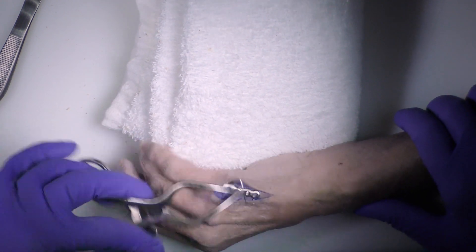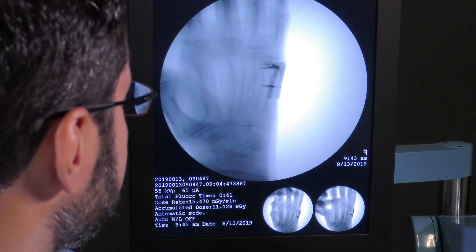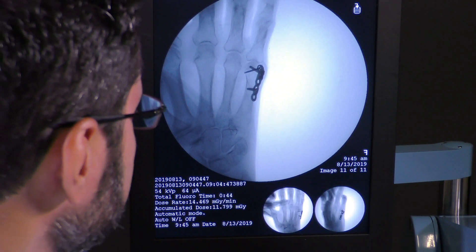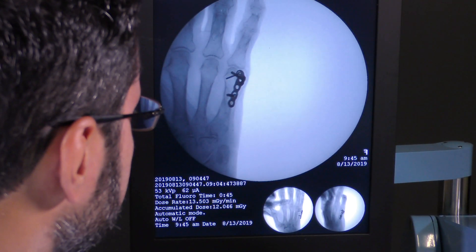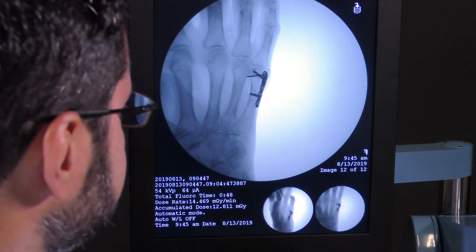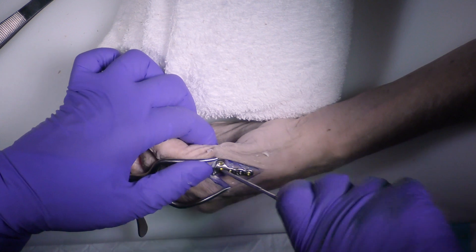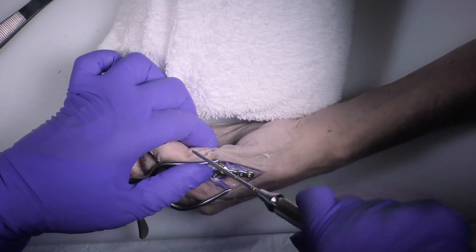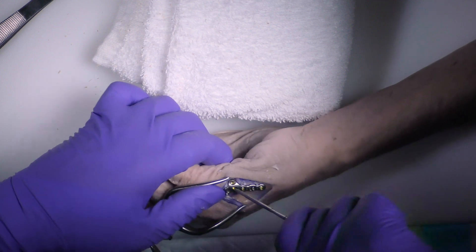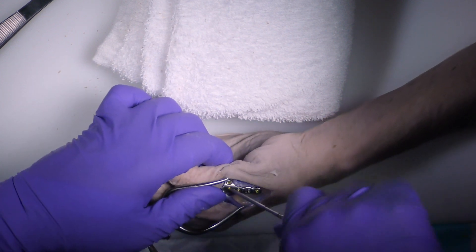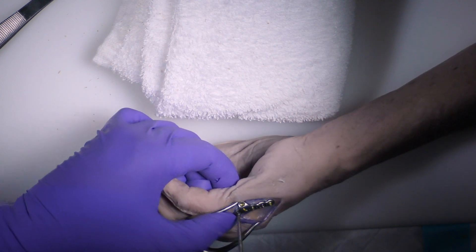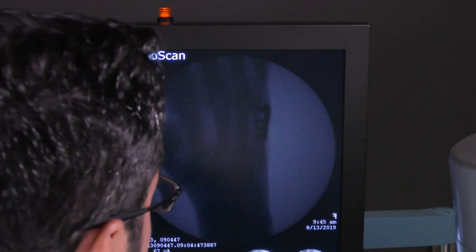So I'm going to make sure that it's still flush with the plate, which it is in this case with a nice purchase. We'll check it on x-ray and you can see how, as intended, it's going upward into the head to capture the distal piece.